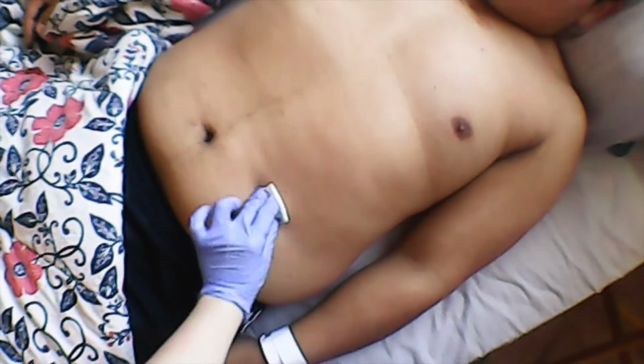It was okay. Okay, just a slight pinch, right? Yes. Okay, perfect. All right. See? All right, there's no bleeding. Just make sure you don't massage that site. We want to avoid any damage to the underlying tissue, okay? Okay. Now I'm going to activate my safety needle and dispose of my sharps into my sharps container.